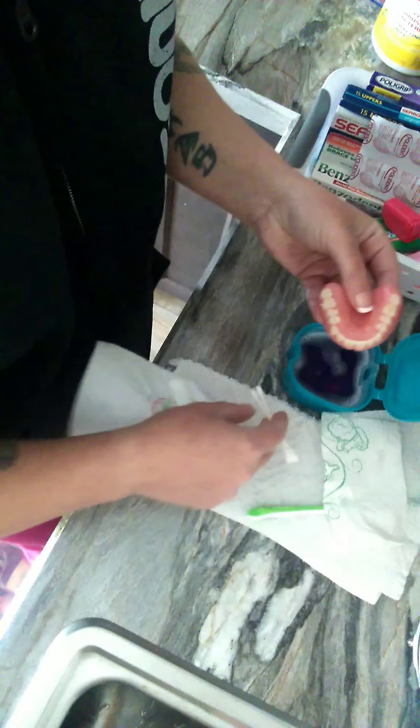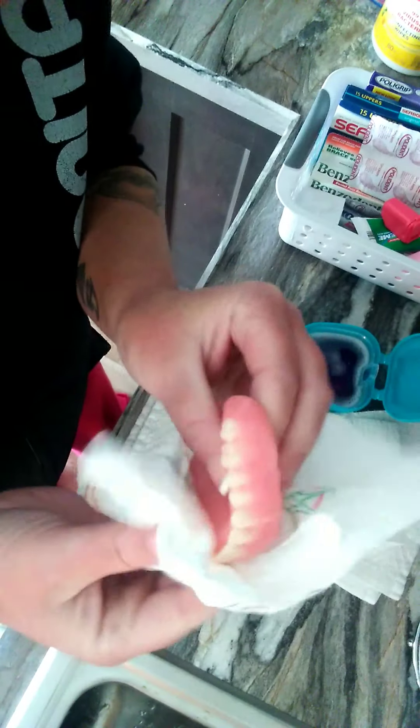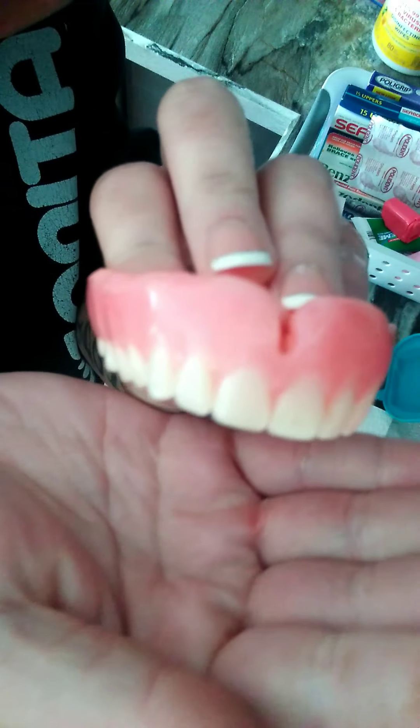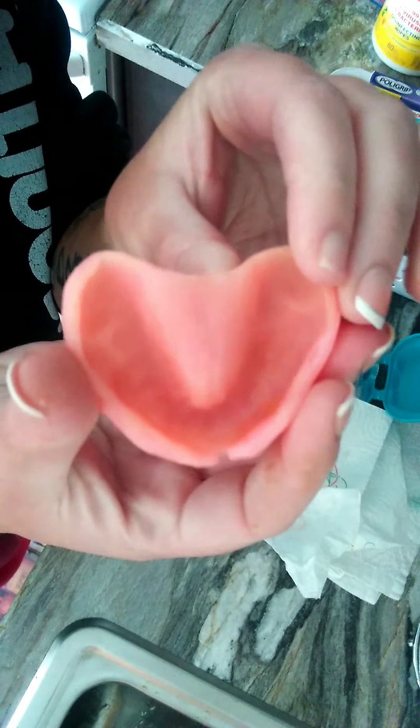Thank you, Steven. You're welcome. And you clean it really well — well, dry it. It's already clean. So that's my denture, and that's what it looks like inside.